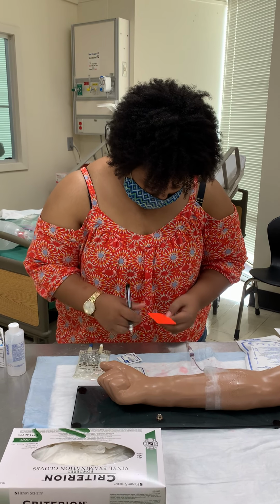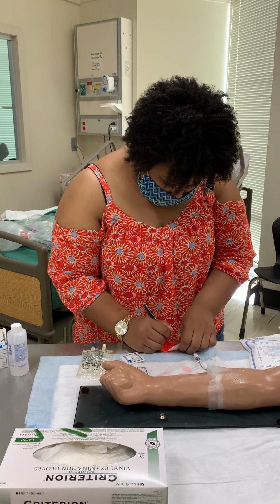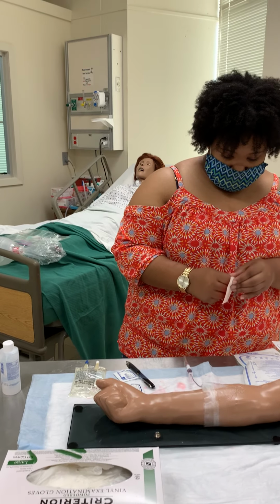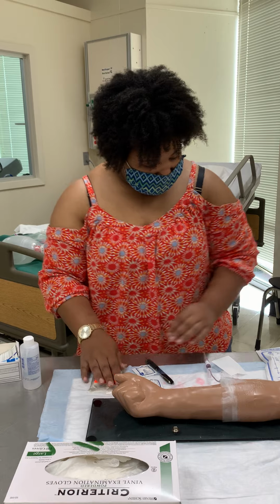Okay, and I'll put the patient's name. So, okay, all right. So now I am going to label that.